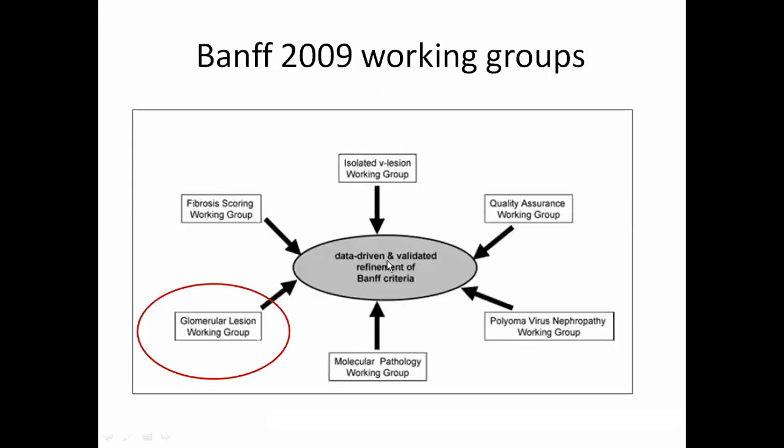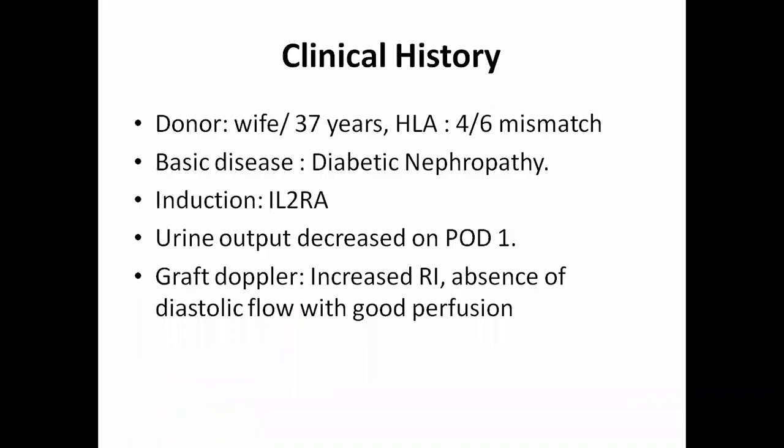So for this isolated V lesion, there was a Banff 2009 working group which was formed just to understand what these isolated V lesions are and how they clinically behave. So before I go into details of these isolated V lesions, I'll show you one more case.